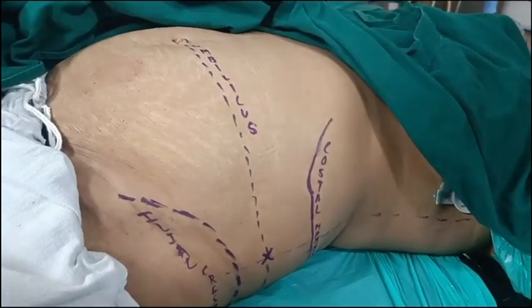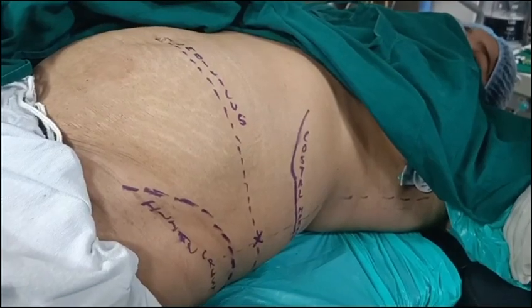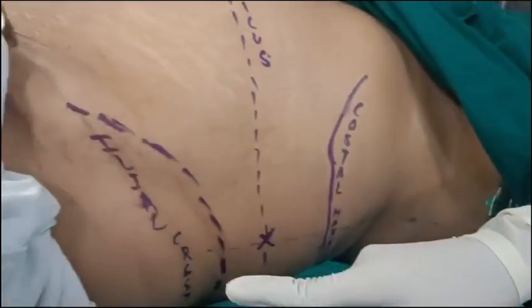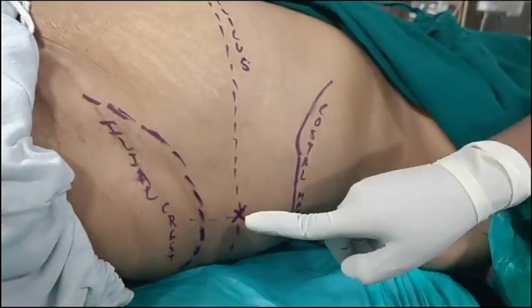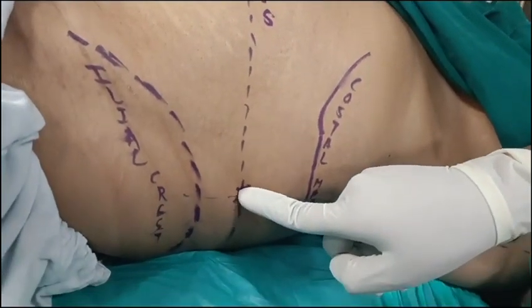Here we have a 30-year-old female patient posted for lap cholecystectomy. Post-intubation, we plan on giving a transverse abdominis plane block, or the TAP block. The landmarks for the TAP block are: first palpate for the costal margin, and then next we palpate the iliac crest. At the mid-axillary line, at the midpoint between these two landmarks, at the level of umbilicus, is the point where we insert the needle for the TAP block.